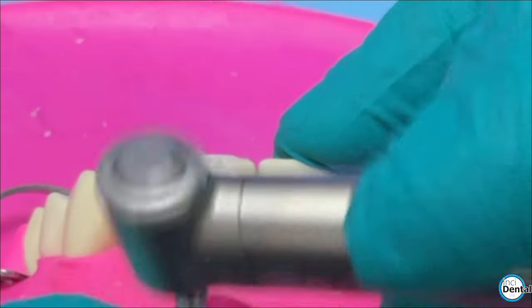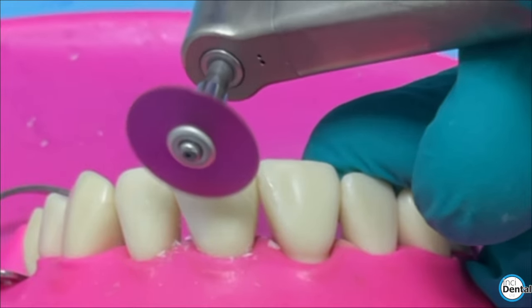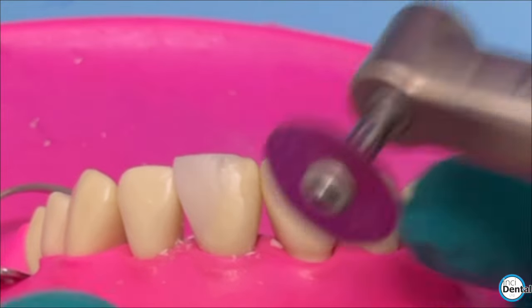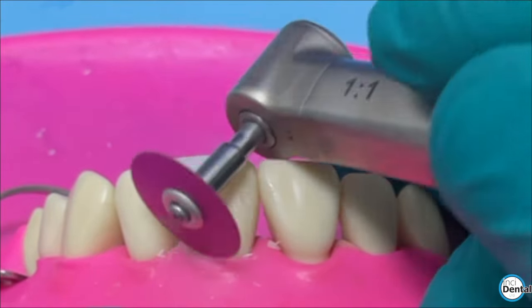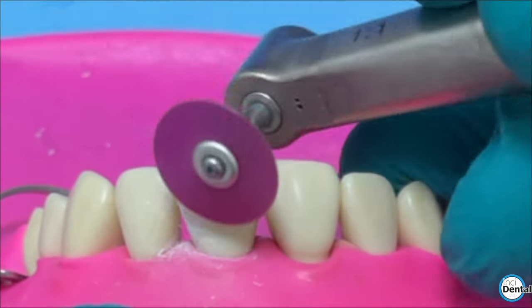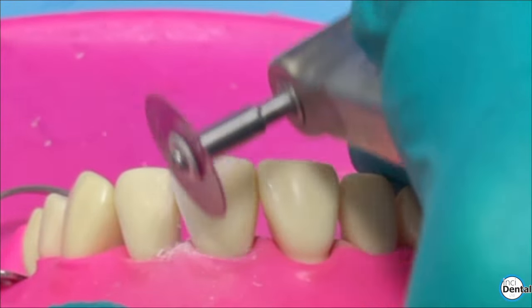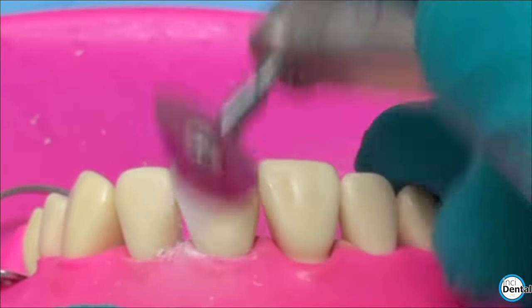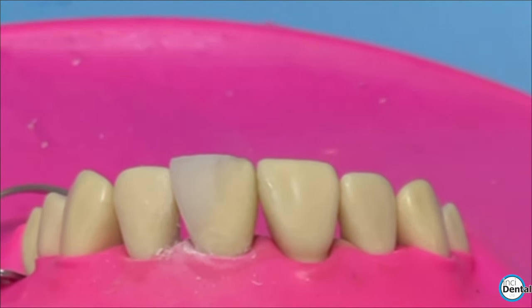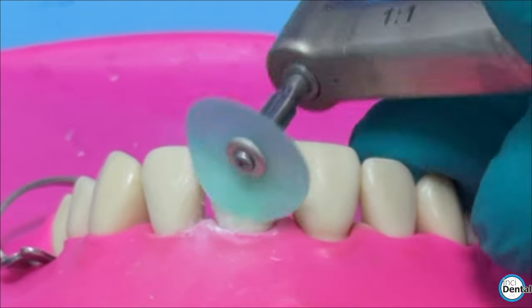Now we're going to use one of Torviem's signature products — their polishing discs. These are all super fine, plastic, incredibly flexible, and come in a range of sizes and grits. Here I'm using the Supercourse flexible disc — a larger 12.7 millimetre disc — for the initial reduction, because it digs in less. It can run with the grit on either the front or the back; here I've got it running back, which is quite controlled. I'm just trying to get the facial plane correct, which is where I'd always start with anterior polishing.